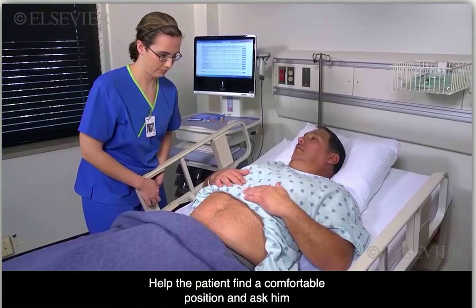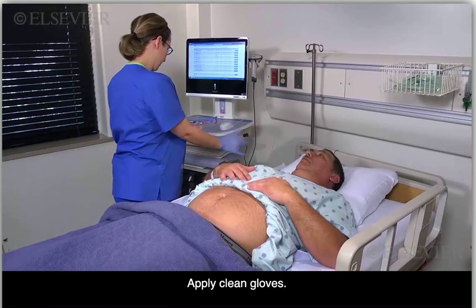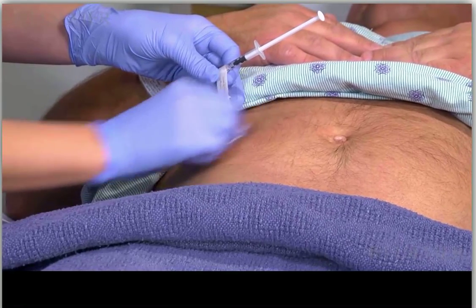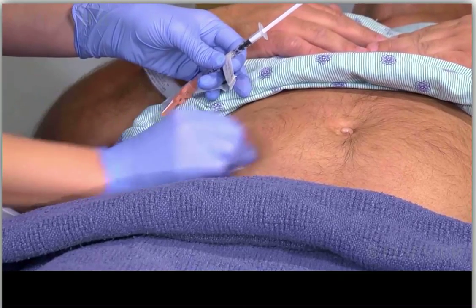Help the patient find a comfortable position and ask him to relax the area you're about to inject. Apply clean gloves. Clean the site with an antiseptic swab. Remember to begin at the center and move out in a 2-inch radius, cleaning in a circular pattern.